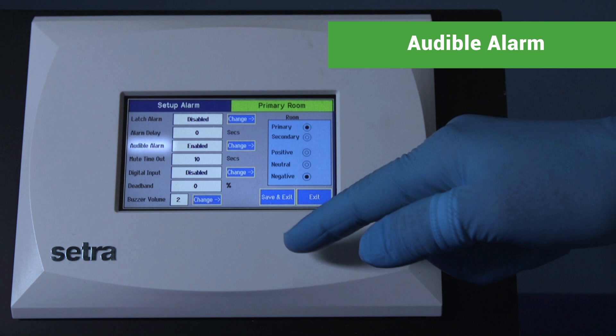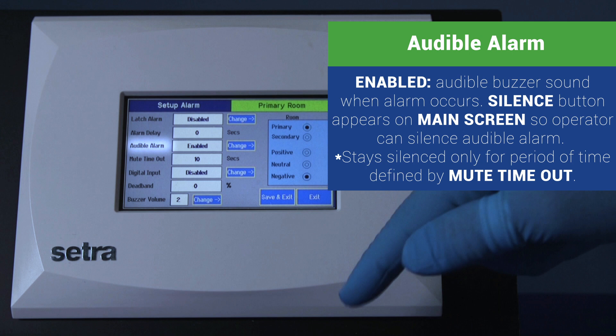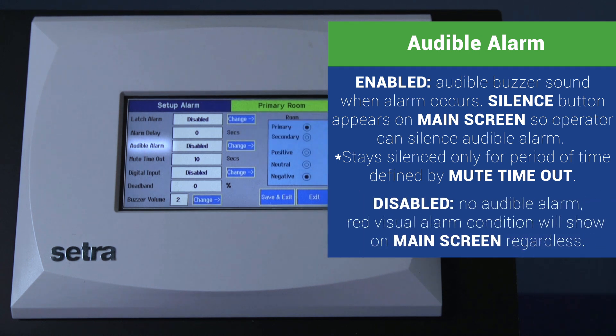Audible alarm — enabled: the audible buzzer sounds when an alarm occurs. A new silence button will appear on the home screen so that the operator can silence the audible alarm. The audible alarm is silenced only for the period of time defined by mute timeout. Disabled: no audible buzzer alarm. Regardless of whether audible alarming is enabled or disabled, the red alarm condition will show on the home screen.